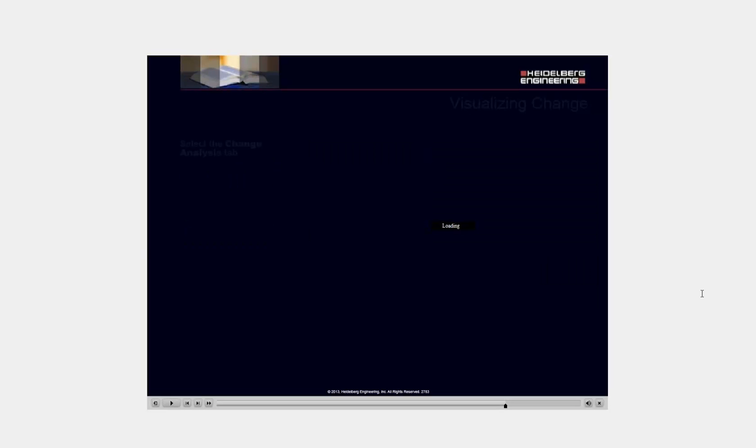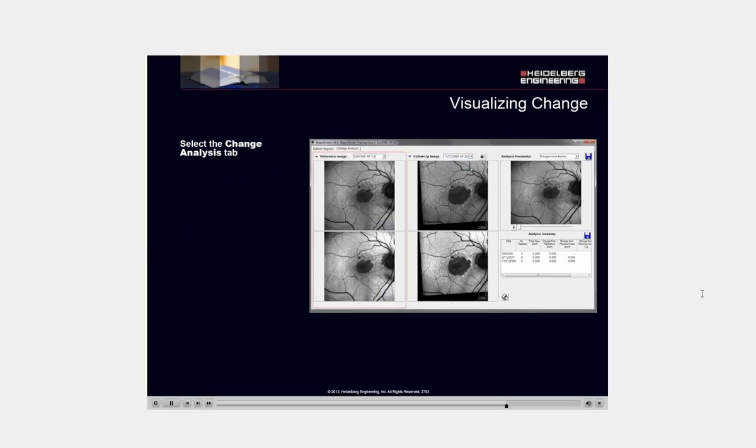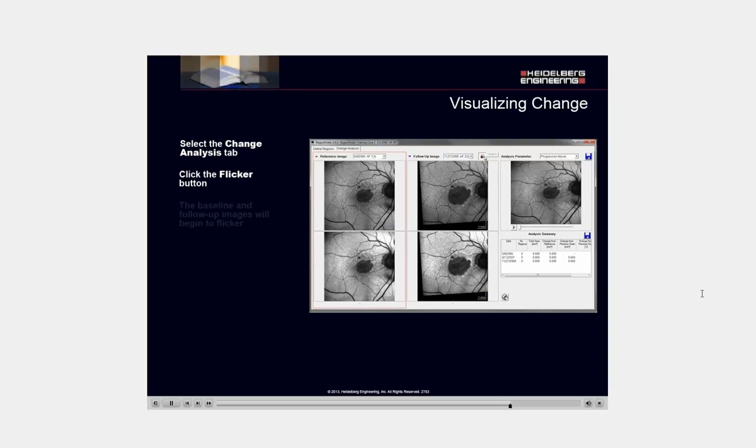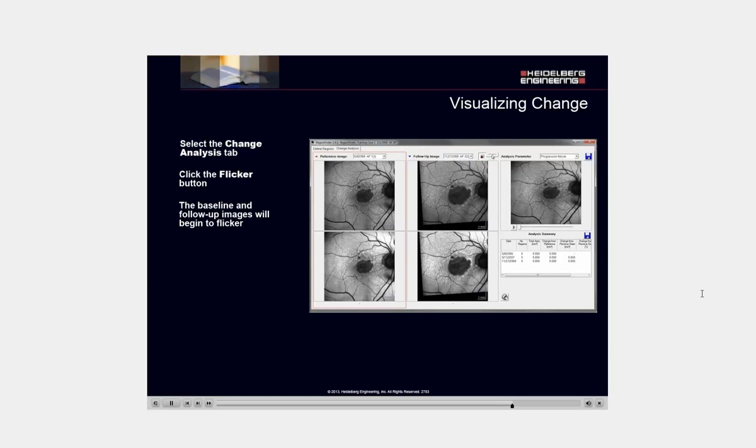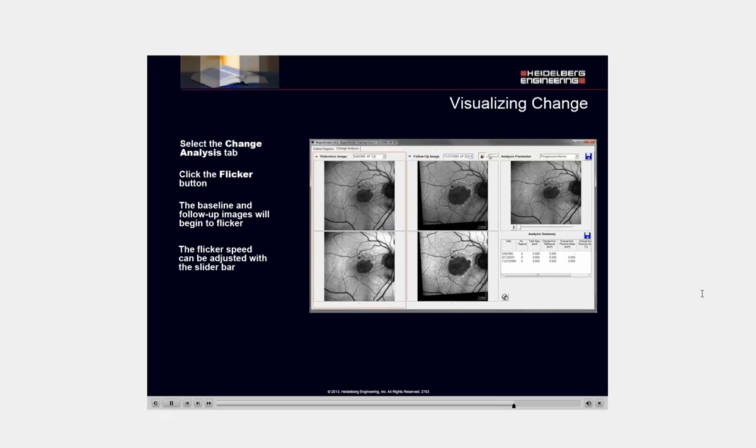Select the change analysis tab. Click the flicker button. The baseline and follow-up images will begin to flicker. The flicker speed can be adjusted with the slider bar.